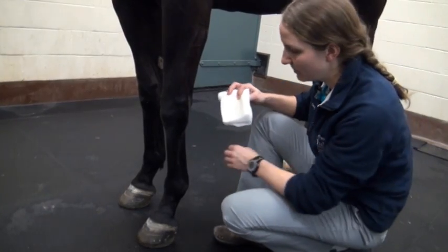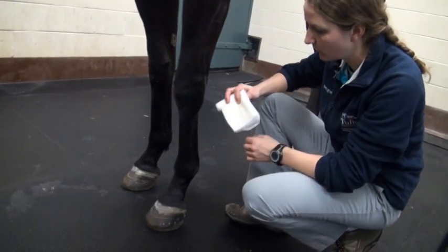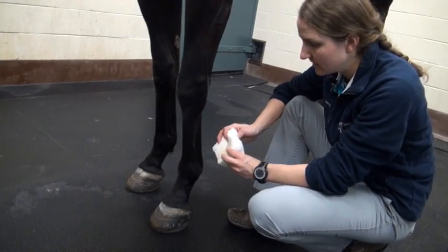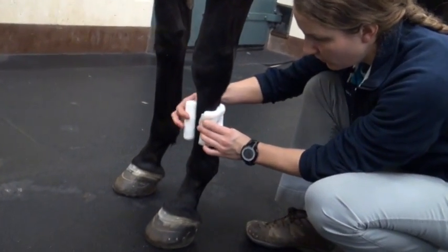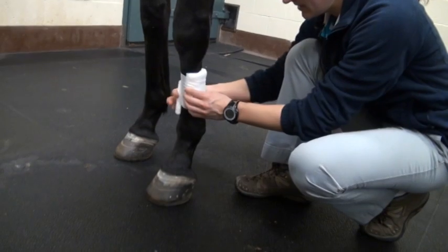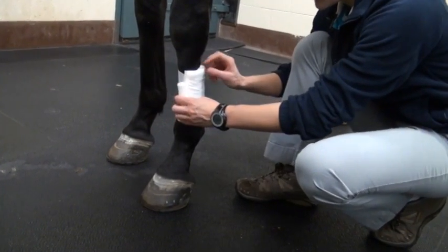So for a distal limb bandage, for example, after a splint bone surgery or if your horse has a wound on their cannon bone, we'll start with the non-stick gauze or adaptic, followed by a stack of sterile 4x4s, and this will be held on with your cling gauze. This should be wrapped over the leg snugly enough to hold the gauze in place, but not very tightly. And this can be taken a little above and a little below the wound to just secure this gauze in place.